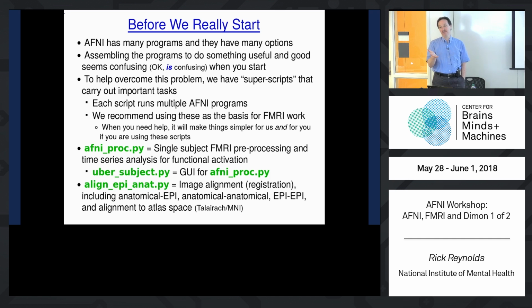Some things are automated for you. They write the scripts for you so you have them, but it's just a good way to think.